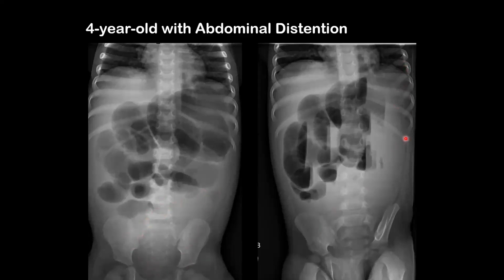On our left lateral decubitus image, the right side is the anti-dependent side, so air will rise to the top. We see a lot of air fluid levels. This is really what an obstructive small bowel gas pattern, or small bowel obstruction, would look like.